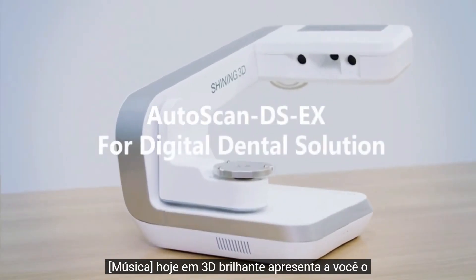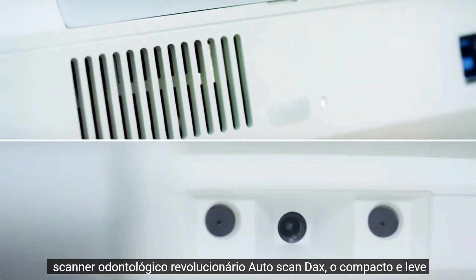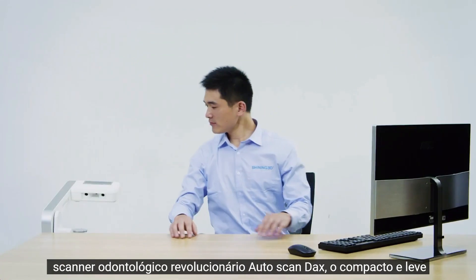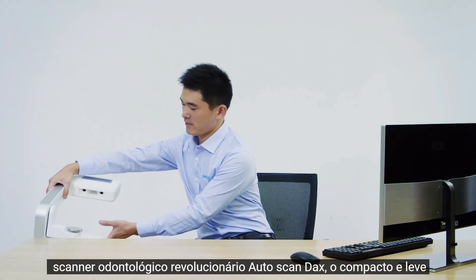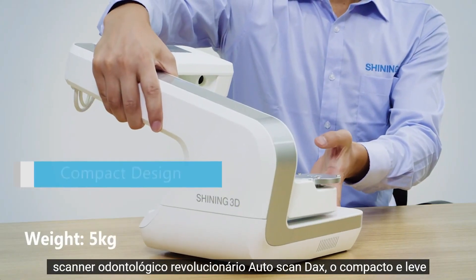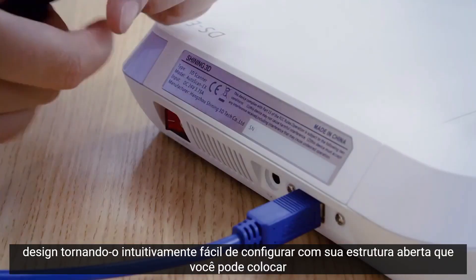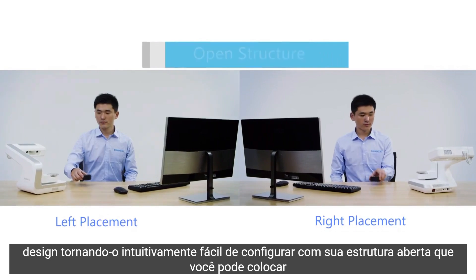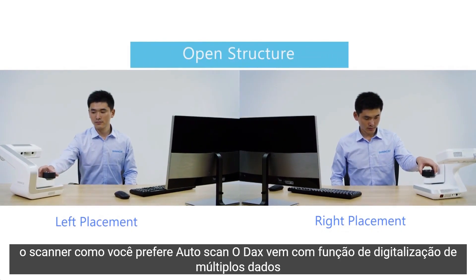Today, Shining 3D presents you the revolutionary dental scanner Autoscan DS-EX. The compact and light-weighted design makes it intuitively easy to set up. With its open structure, you can place the scanner as you prefer.